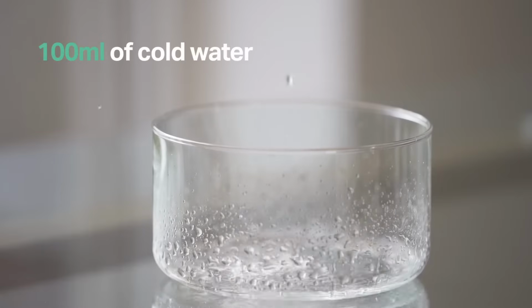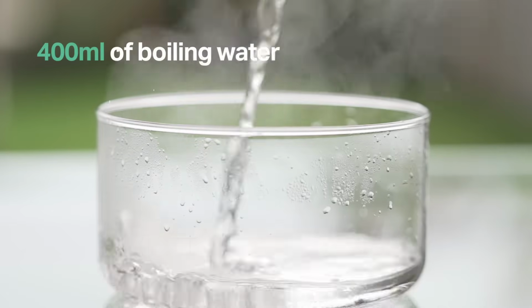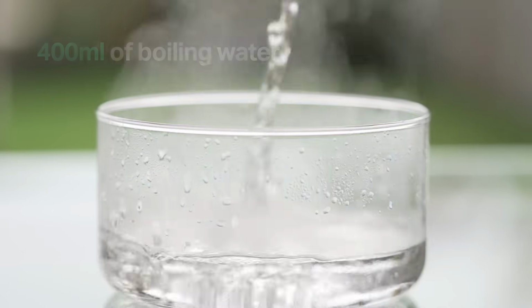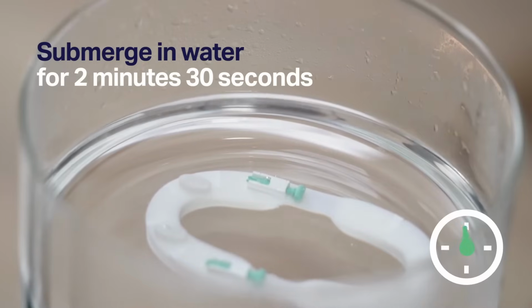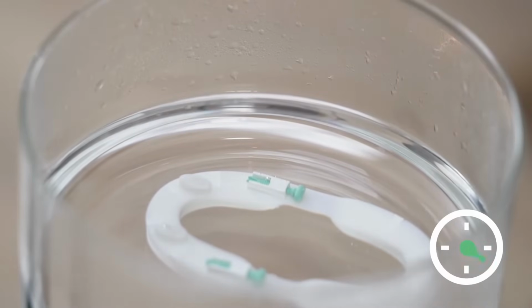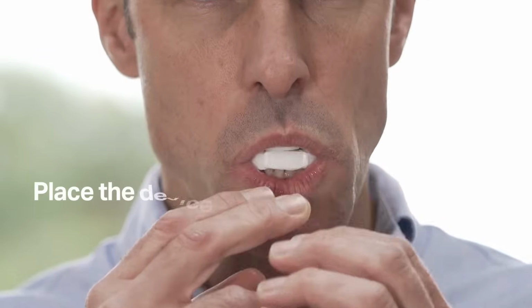Fill a bowl or a jug with 100 ml of cold water. Now add 400 ml of boiling water. With the oral device fully flat, submerge it in the water for 2 minutes and 30 seconds. Carefully remove the oral device from the hot water.